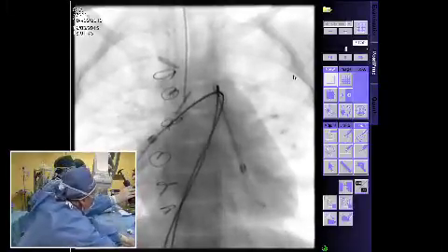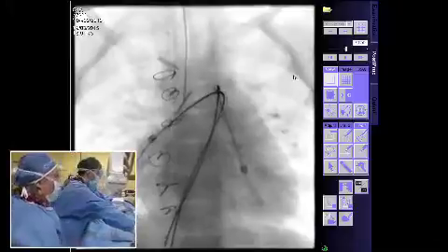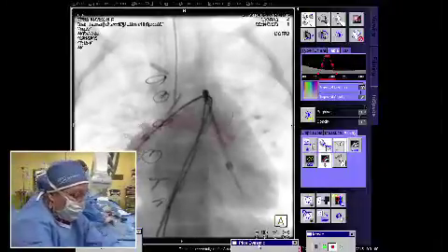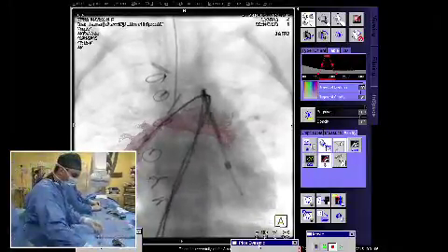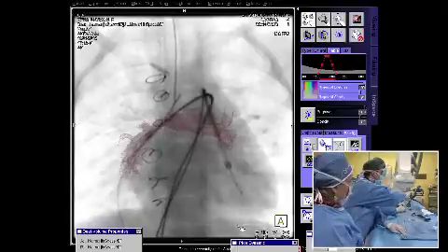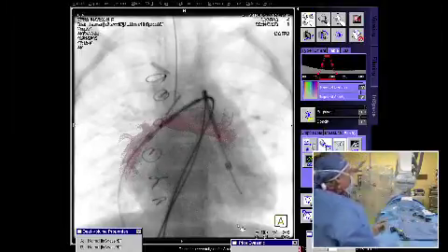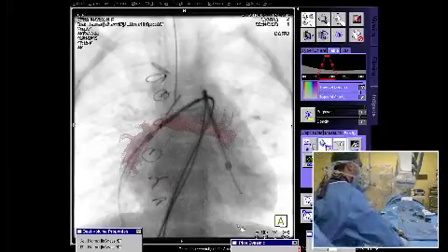Yeah, we may decide the angle to be used. Okay, I'm advancing the stent. You see the stent coming towards John, the left side. That's very important to select the most proper projection to optimize the visualization, deployment, etc. However, the problem is when you have bilateral stents, an optimal projection for one stent would be different from the other one. So I think we have to make a compromise between the two, yes.